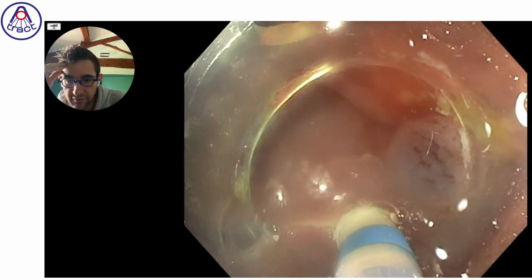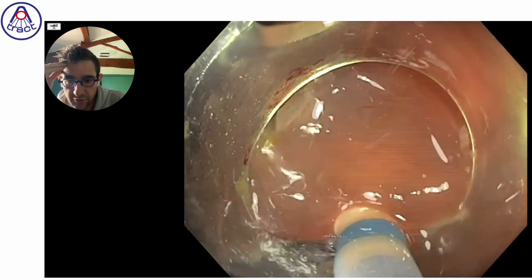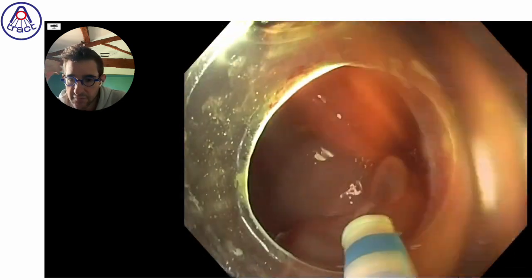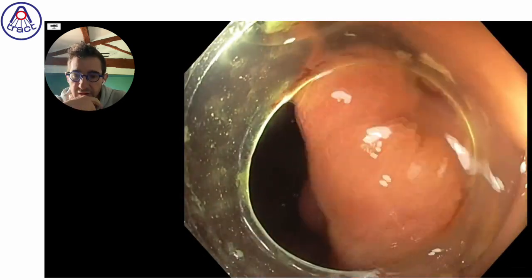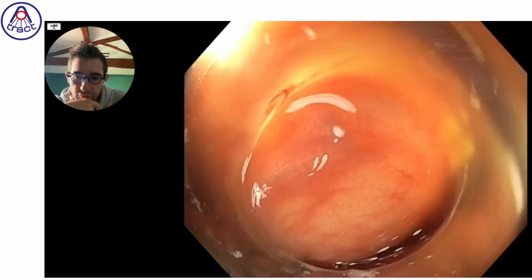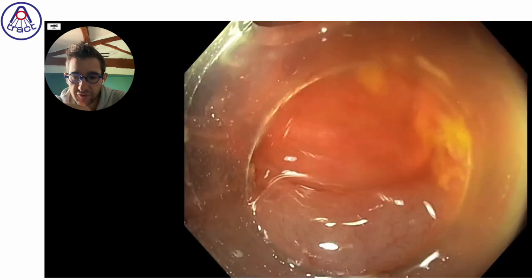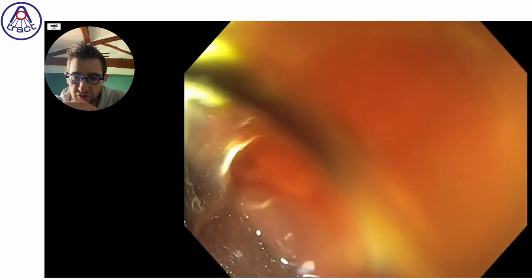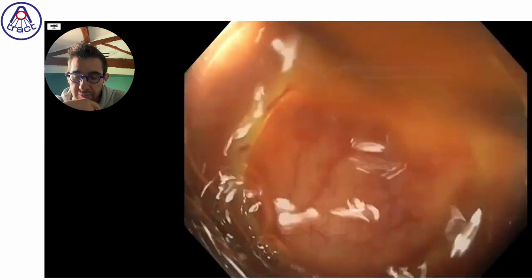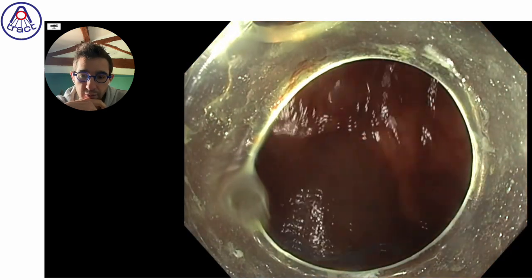But you see, everything is not at the same depth, my position is not very good, the scope is not perfectly stable. So once again, it was not the good choice in this case. If there was the possibility to redo it, I would do first all my oral incision, with the first incision doing the cecal side first, and later the other one that was really easy compared to this one.